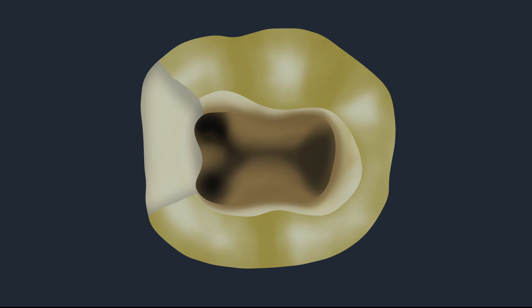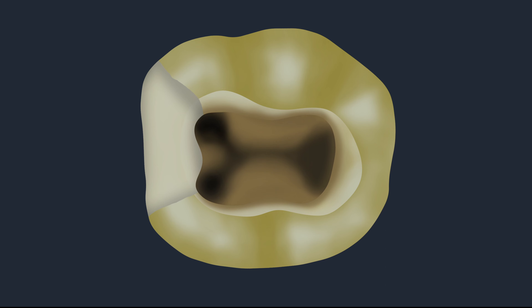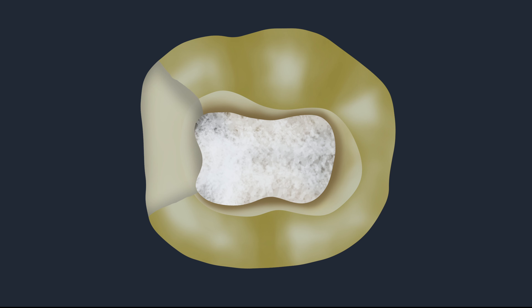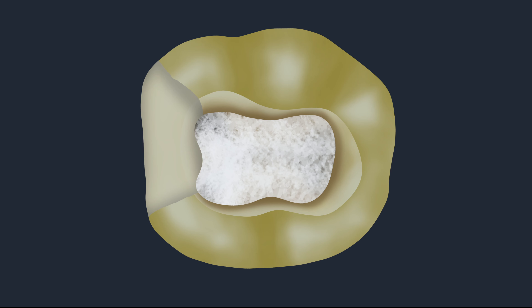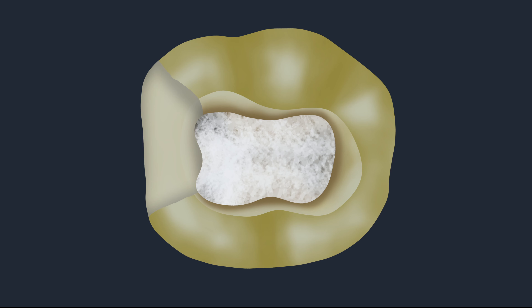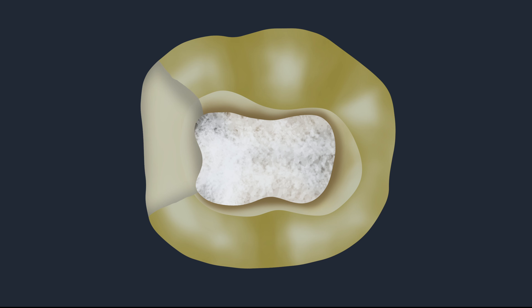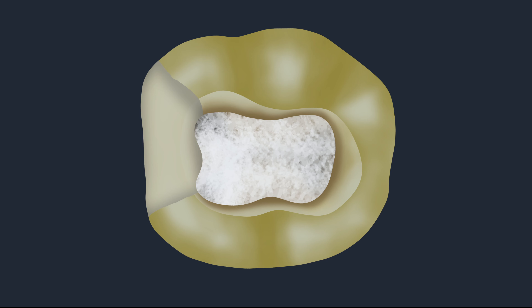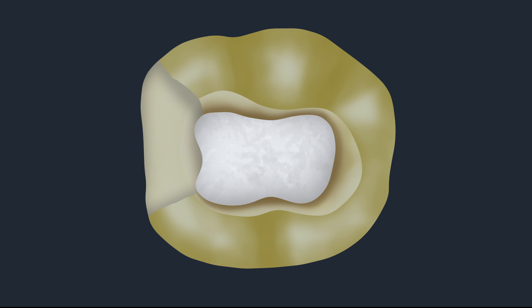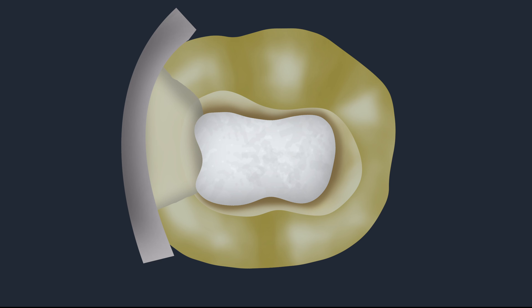In those situations with extensive decay, how do we do a pre-endodontic restoration? Let's imagine a tooth where one wall is lost during caries excavation and the entire pulp chamber is open. One prerequisite: the root canal orifice or the pulpal floor should be blocked with a cotton pellet. If we do not do this, the bonding agent used for restoring the lost wall will seep inside the pulp chamber and may block the root canal orifice. So a cotton pellet must be placed, and on top of it, a thin layer of temporary filling material is applied.